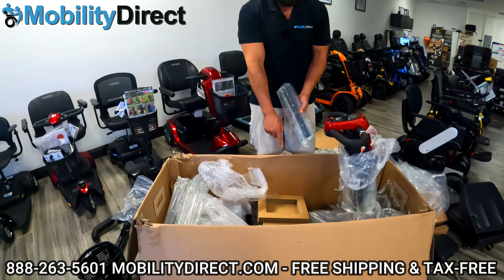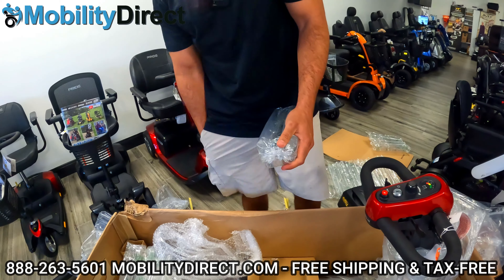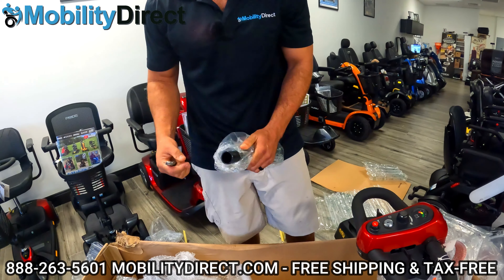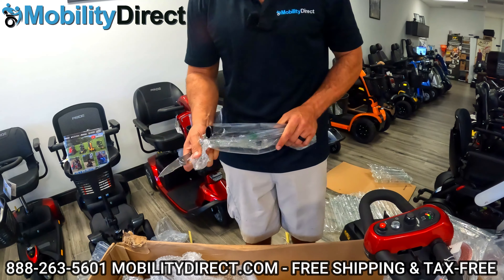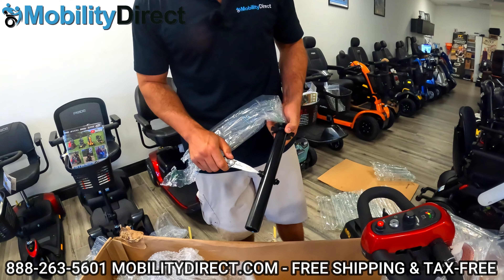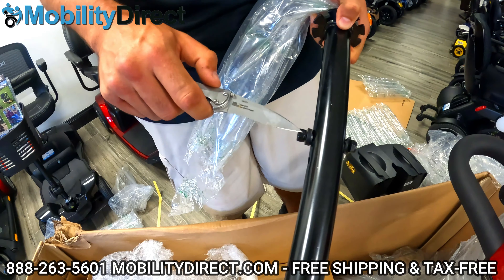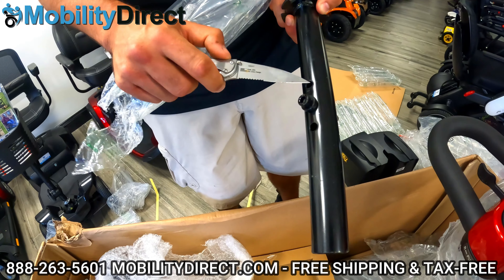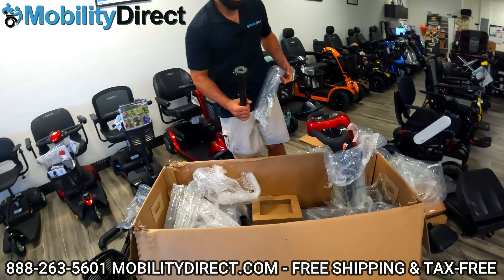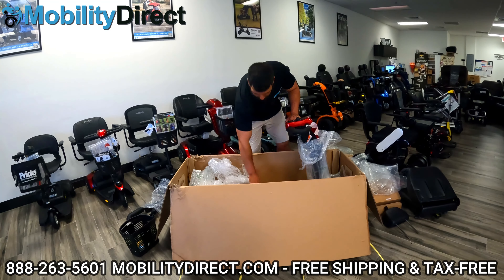Right here between the two battery boxes, you've got your seat post — this is a really important piece, don't want to miss it. The seat post is what's used to attach the seat to the base, and it is height adjustable. You're going to need a set of tools to undo it — it's a little hex bolt and nut with a curved washer that hugs around the seat post on both sides. You've got three different increments, about one inch each, so you can raise or lower the seat height depending on how tall you are.